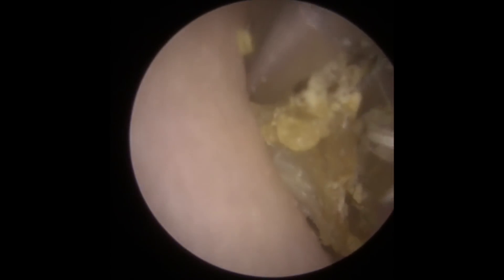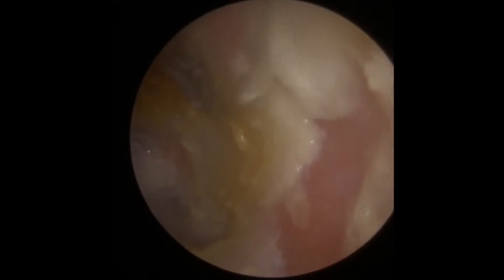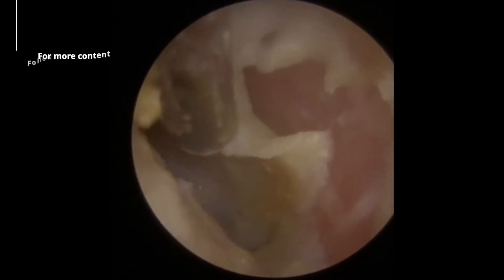A little bit just broke away there with the forceps. You can see the whiter material there just underneath — that's where it's been holding on quite tightly in this canal. I've got some good movement to it there though. I've taken one side of it away and brought it all forwards in the canal, so we'll just grip it again. You can see all that dead skin material underneath. That's why it's difficult to tell whether this is skin or wax; it's kind of very closely mixed together. There's a lot of dead skin discharge and bits and pieces underneath here, so we're just peeling that away.